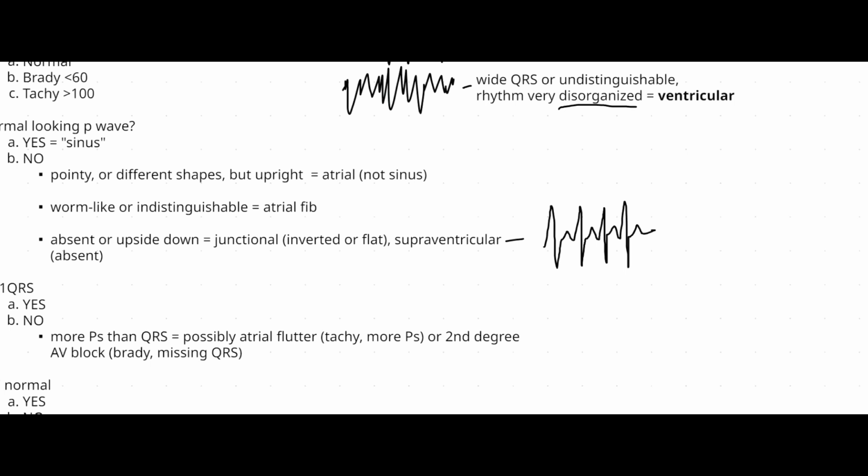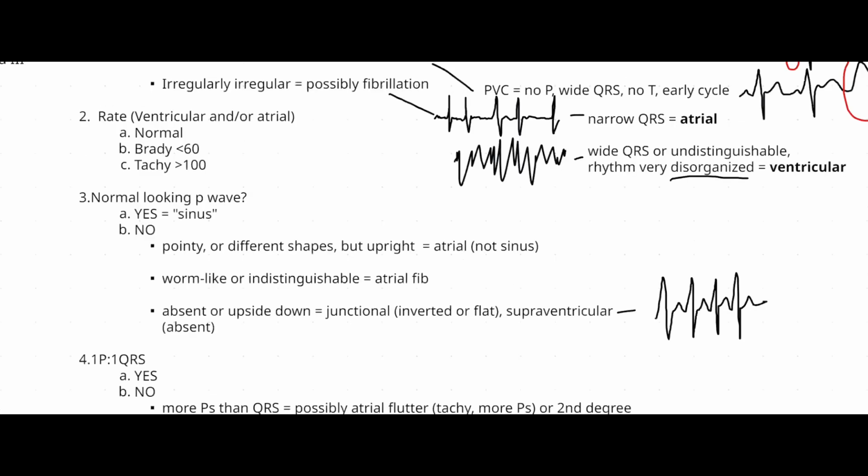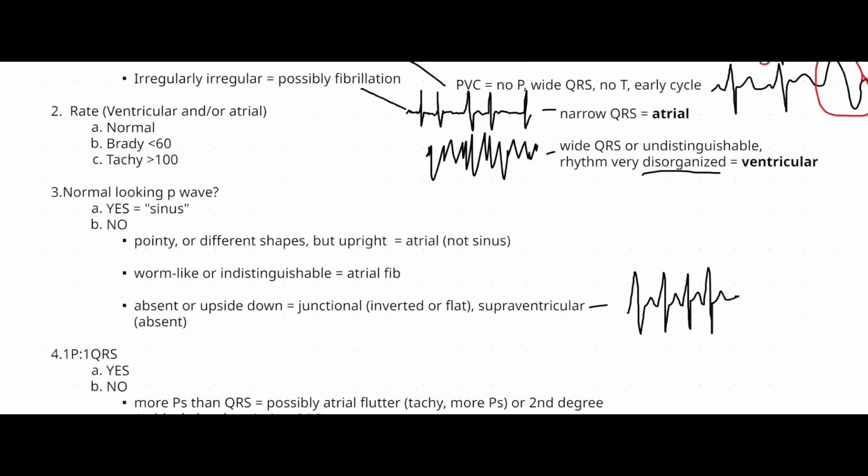Okay, so flutter we haven't talked about yet, but we will now because you guys mentioned it. So here we'll talk about flutter... I'm not actually there yet, guys. So actually, no, I'm going to defer talking about it until we get to the next criteria, which is right below. We're getting there.